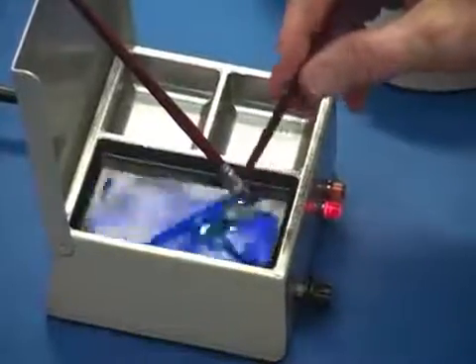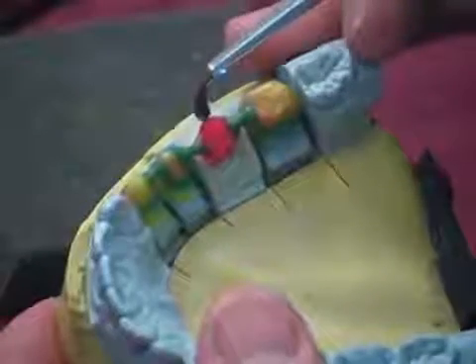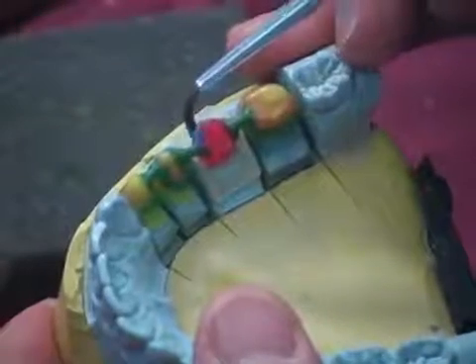It is imperative that the hot pot is set at a very high temperature when using Galileo brushing wax, as the wax will cool as it is carried to the work.